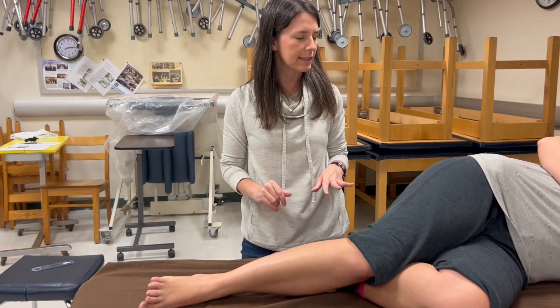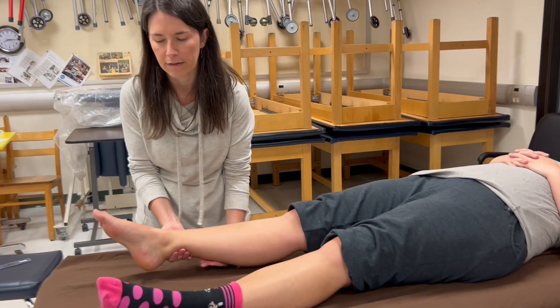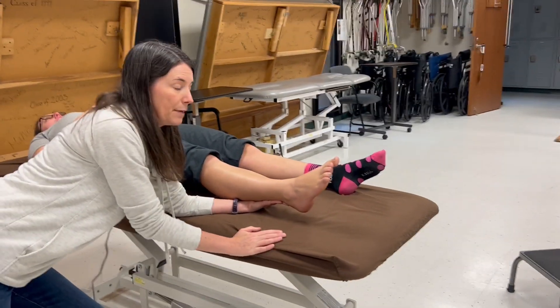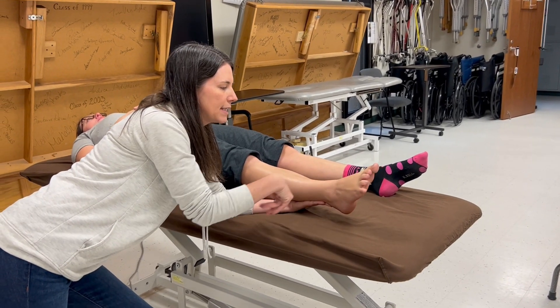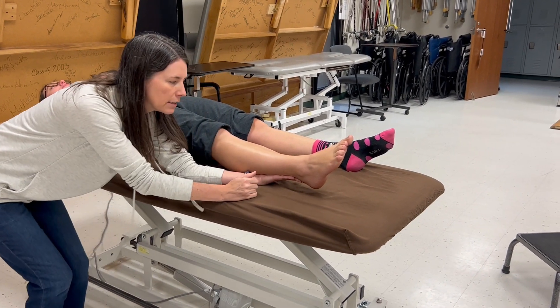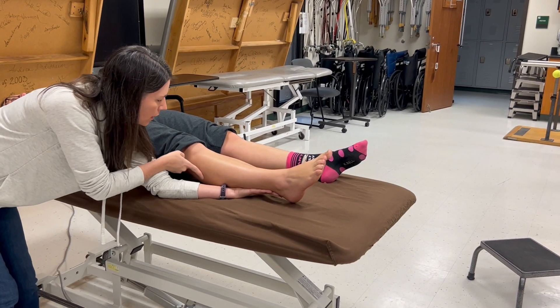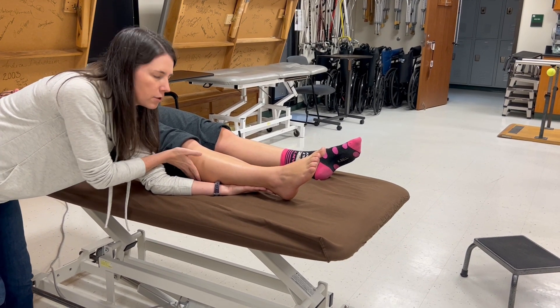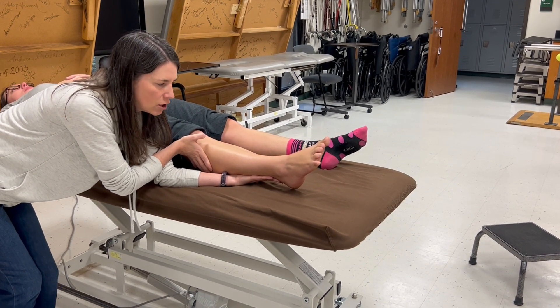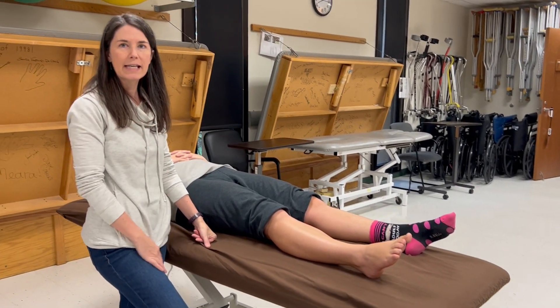For gravity-eliminated eversion, supine is much closer to gravity eliminated than short sitting, so we use that. I prop her foot up to reduce table friction and say: can you bring this foot out toward the side? If she can do that, that's a two. If she can't, I palpate fibularis longus — also called peroneus longus — at the proximal third just distal to the fibular head. If she can't move but I feel anything there, that's a one; nothing is a zero.